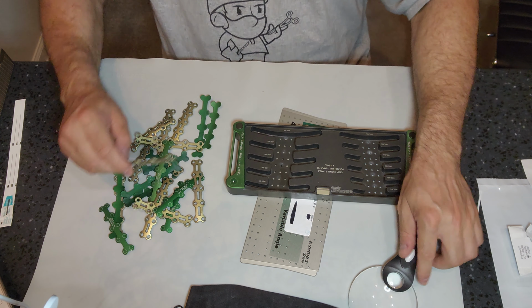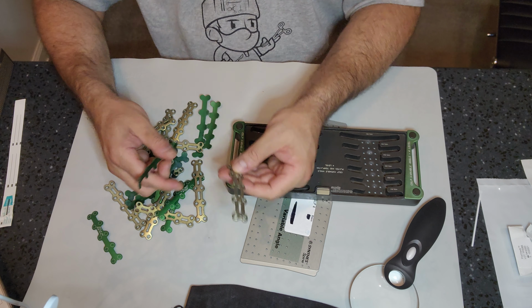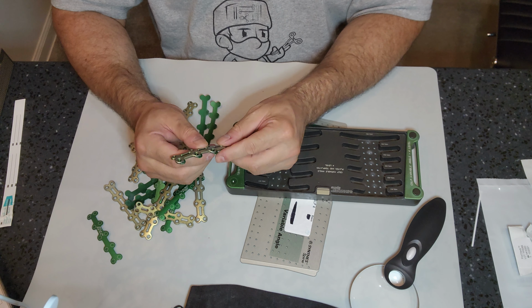Now this is implants with trials. So I'm marrying up the implant with the actual trial, and that is basically lining up the holes with the holes in the implant, making sure it's the right size. On each implant there is a number. So this one is 450190, and that goes right in that slot right there. I'm going to grab my next implant and try to marry it up with the next trial, right?